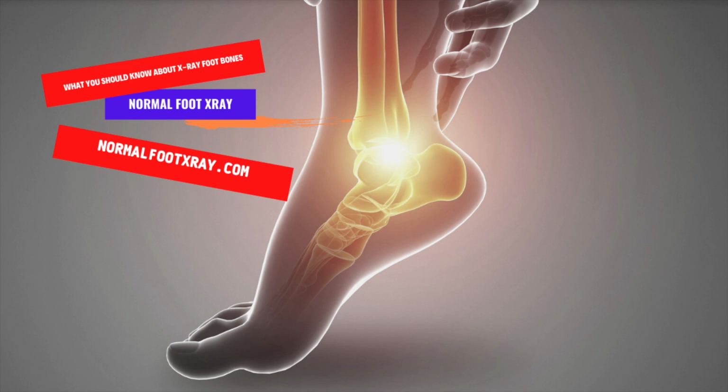If there is anatomical damage, a lateral X-ray will reveal it. An oblique X-ray will show the phalanges and the interphalangeal joint. The medial cuneiforms and sesamoid bones are visible on an oblique X-ray. In a normal foot, the navicular bone is seen. An oblique X-ray is also helpful in identifying fractured bones.